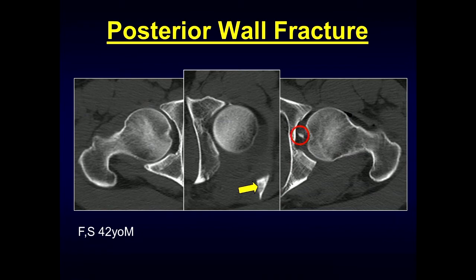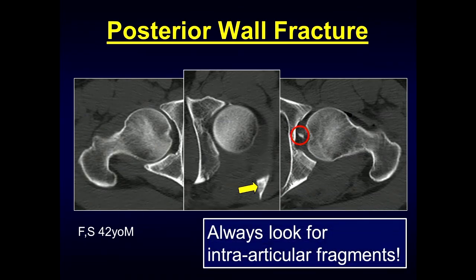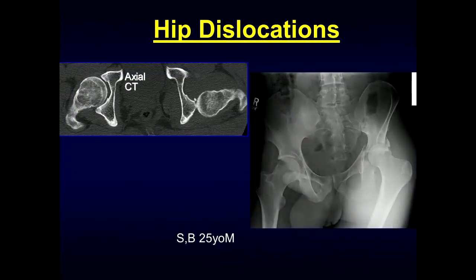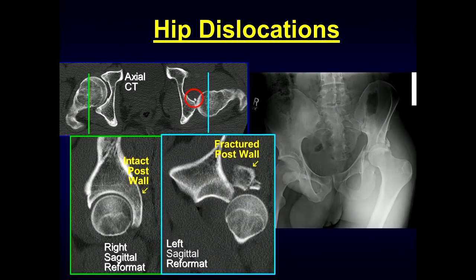Always look for intraarticular fragments following dislocation injuries. In this patient with a posterior hip dislocation, we see a small intraarticular fragment. Comparing the right to the left side, there is a comminuted fracture of the posterior wall, and the femoral head remains in contact with the posterior acetabulum, which has prevented reduction.